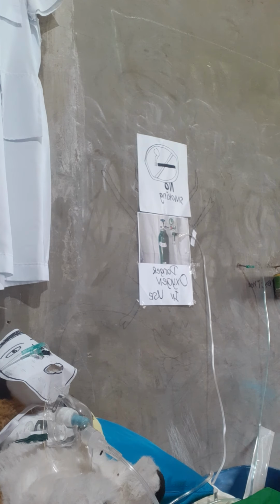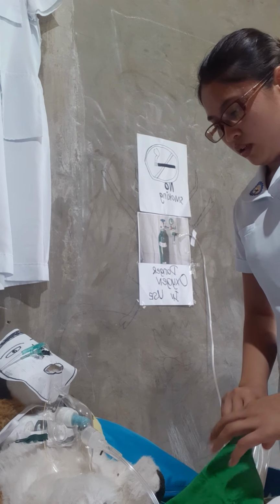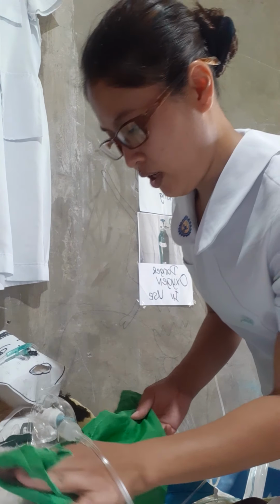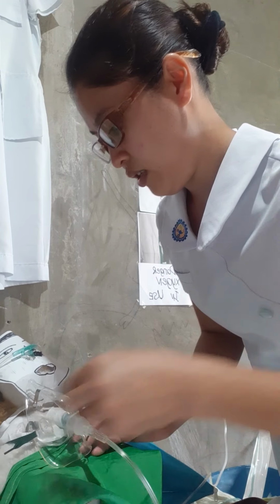Afterwards, we need to place a rubber pad on the chest of the client to protect him from any secretions.